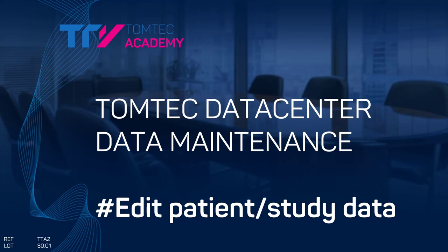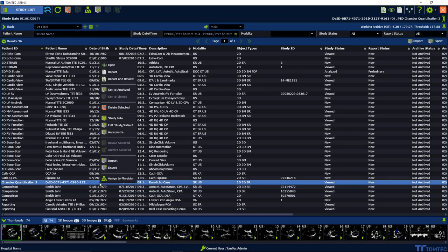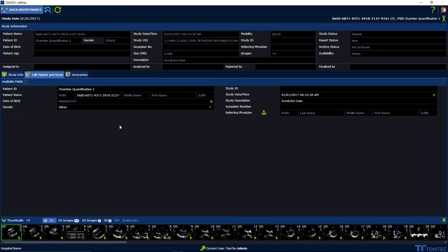How to edit patient and study data in TomTech Data Center. Select a study in the list. Press the right mouse button to launch the submenu, then choose Edit Study Patient.